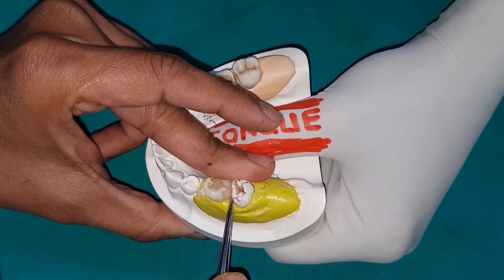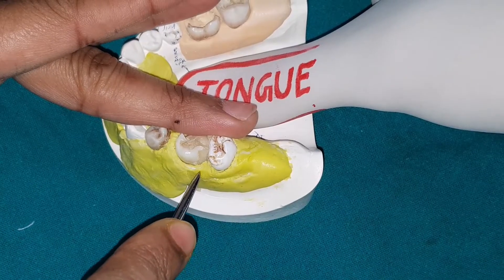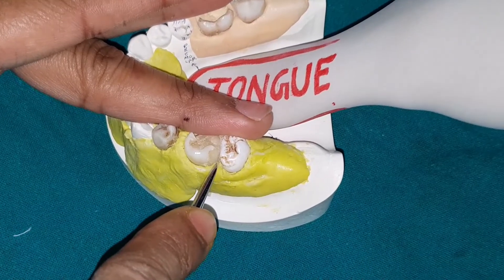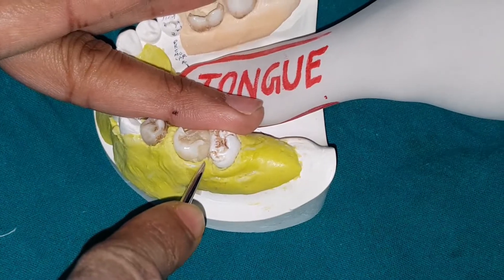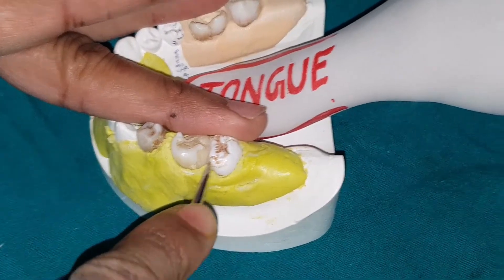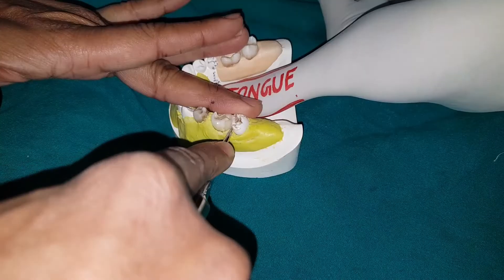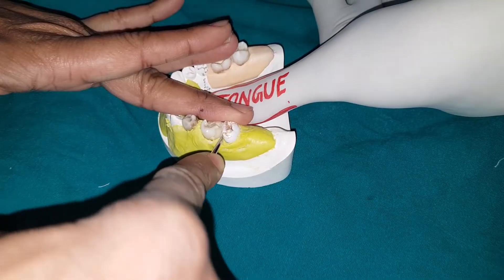Wedging should be done in a small screwing manner — back and forth movement, back and forth — like this. It will generate some forces on the adjacent tooth initially. This is wedging.